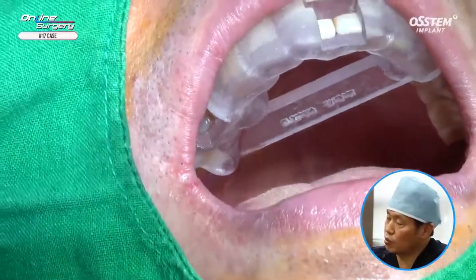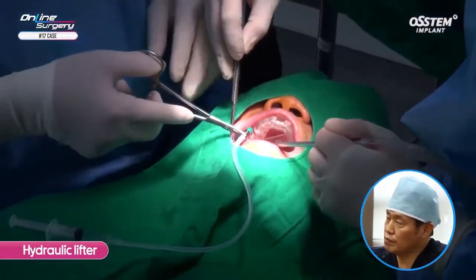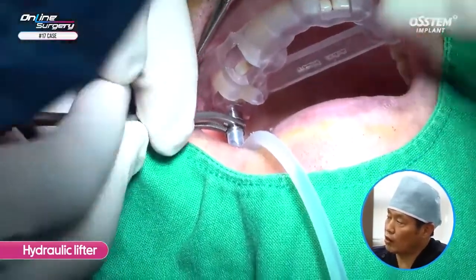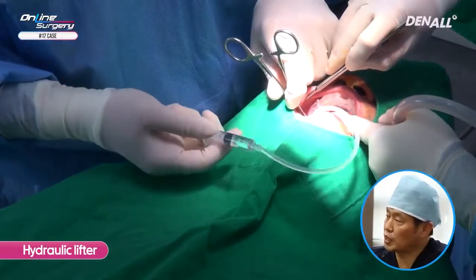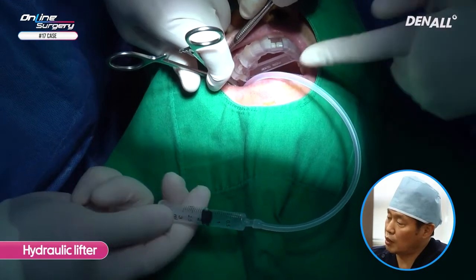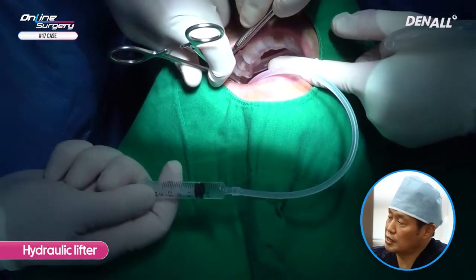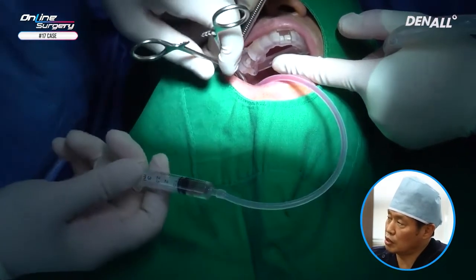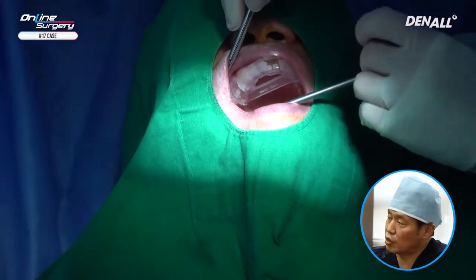I asked the patient to blow with his nose to check if there was any problem. I'm going to lift the sinus using hydraulic pressure. Unlike the old kit, with the OneCast kit you don't need to remove the template to do hydrolift. In the 3 cc syringe there is 2 cc saline. I proceed slowly by 0.5 cc followed by aspiration, repeating this process, and have lifted the sinus floor by 1 cc. Upon aspiration, blood comes out together with negative pressure, confirming sinus lift was done without sinus membrane perforation.